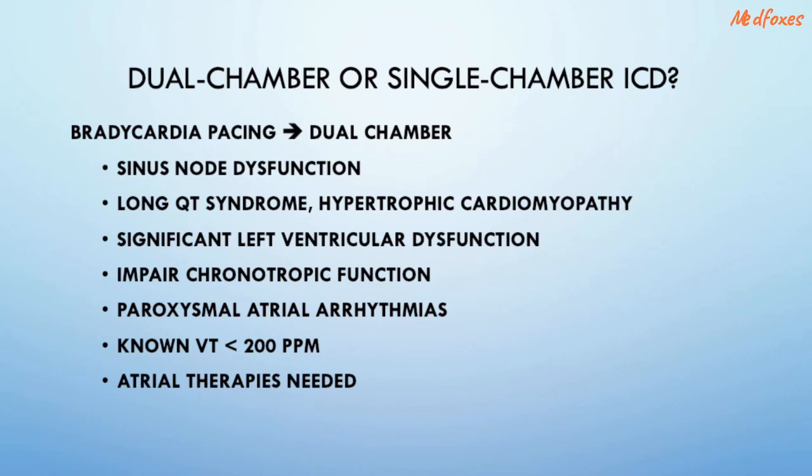The single most important decision in selecting a defibrillator is determining whether to implant a single or dual chamber system. The decision may be influenced by several considerations.